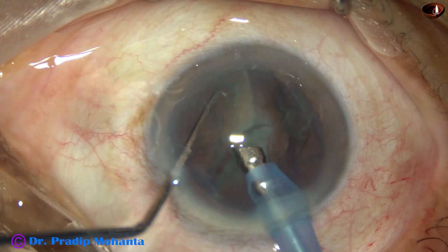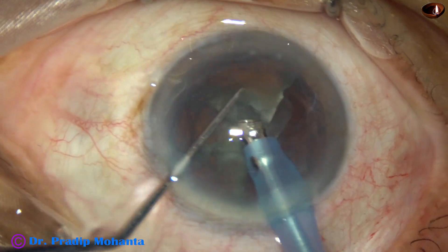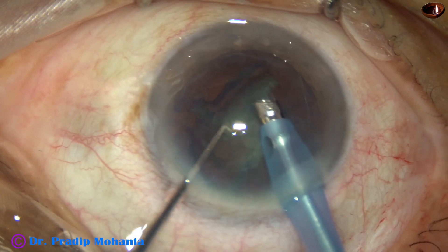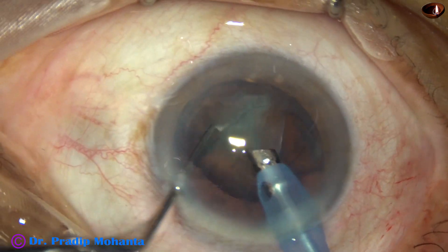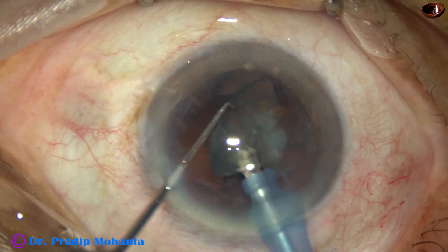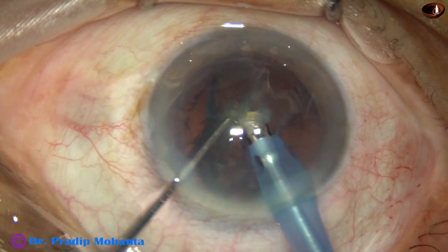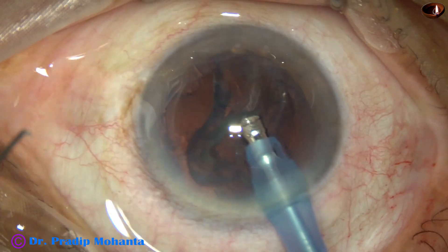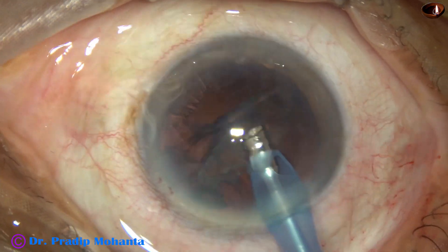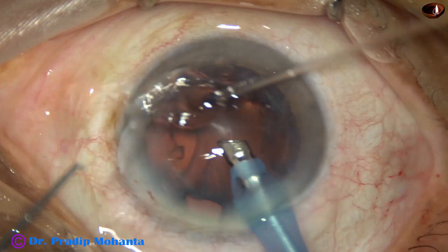Two pieces are already emulsified. In all these cases, the ultrasonic energy is set at 60%, though the ultrasonic energy being used is much less, about 30% to 40%. Flow rate is 40 ml per minute and vacuum is 400 mmHg. This is the Faros from Oertli, Switzerland. Done.